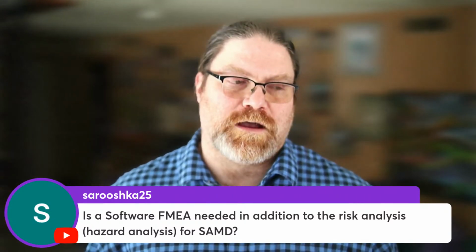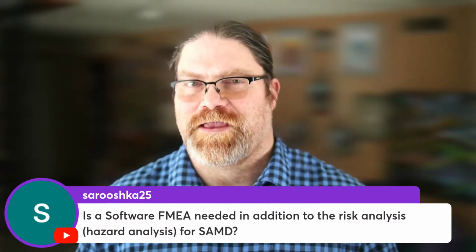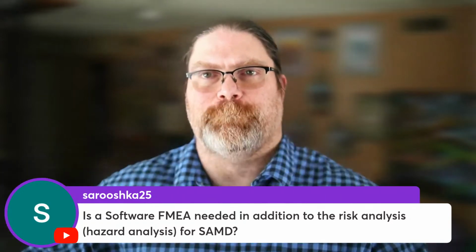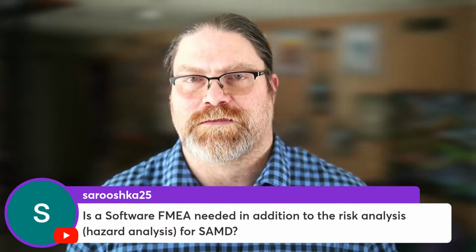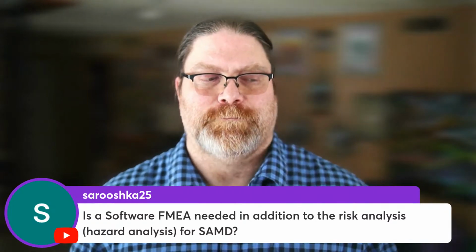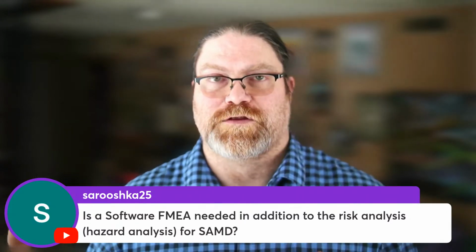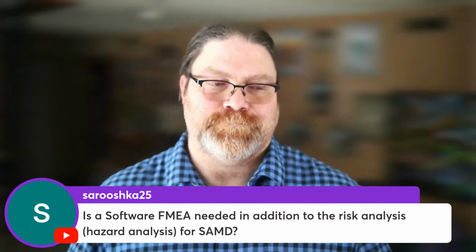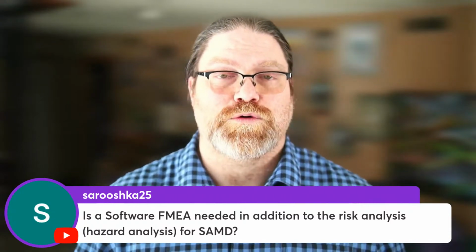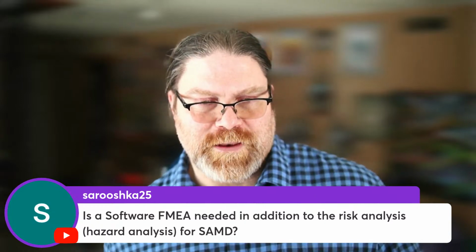Whereas with an FMEA, you start with all the things that can fail, but software doesn't fail the same way hardware does. So an FMEA is much better suited for a bottom-up approach when you have components. You can still use an FMEA, but the fault tree is a better tool. And to answer the basic question, yes, you can use an FMEA. You don't have to do some other tool also. But if you haven't built it yet, probably you want to think about what is the best tool to be doing this in the first place, and it might not be an FMEA for software. I hope that answered your question there.